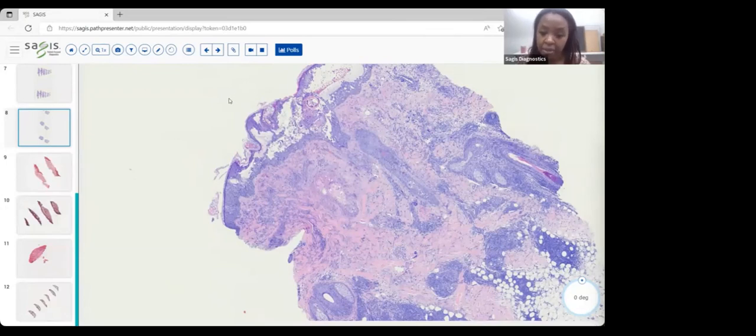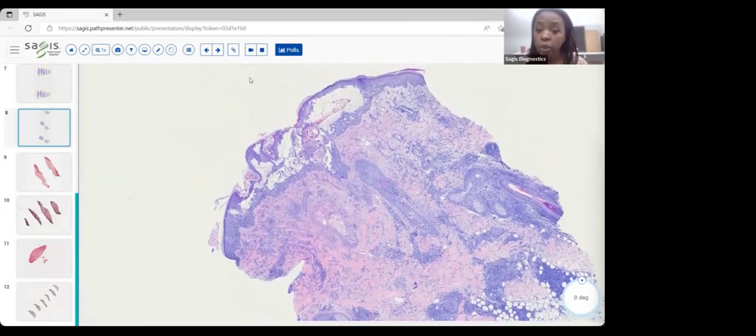There are scenarios where you really just have a vasculitis, a dermal vasculitis. So that can be very tricky. And then you can also just get involvement of eccrine glands, and it's more of a nodular lesion clinically that you see when you have zoster that's really localized to the eccrine glands. So that's very tricky as well.